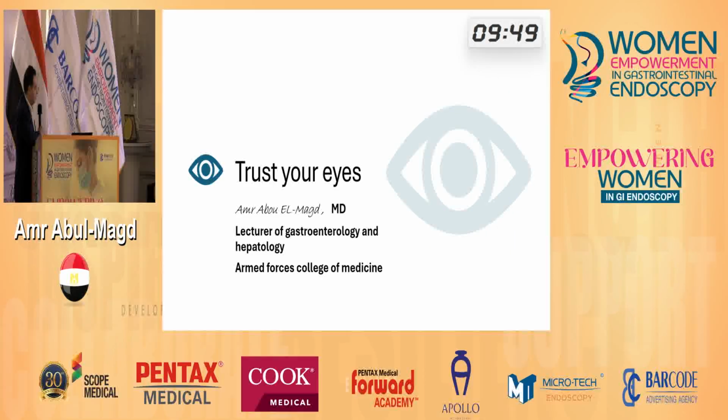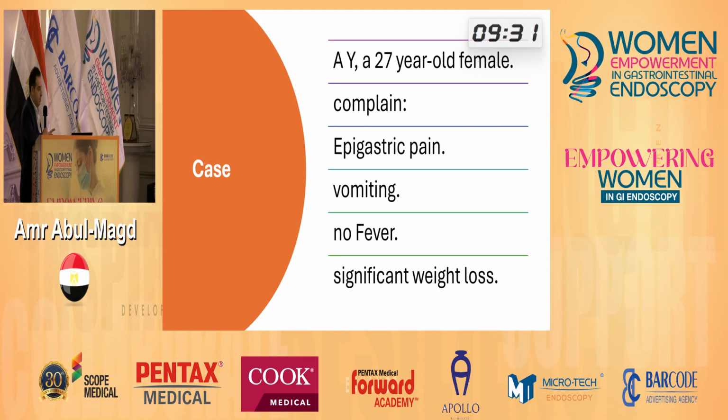Dr. Nada asked me to talk about a simple case of FNA or FNB. I found this simple case really helps you to trust your eyes and your needle. I have a case that was transferred to me from one of my eminent colleagues for cystogastrostomy in a patient diagnosed with pseudo-pancreatic cyst.